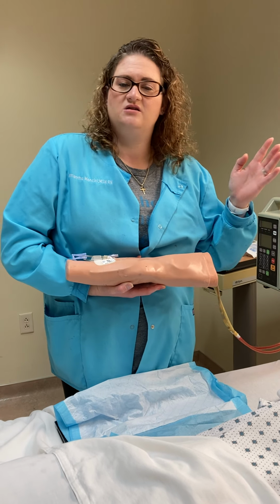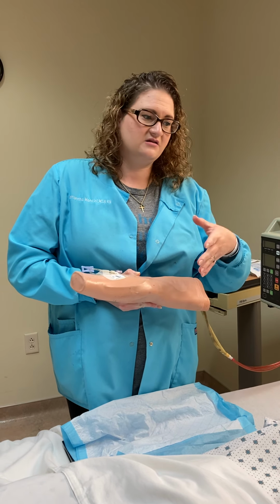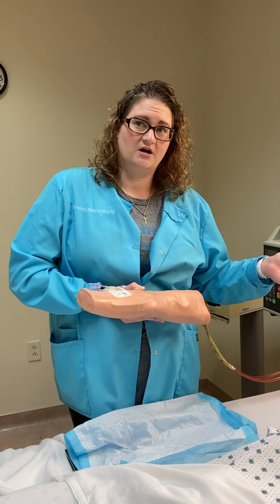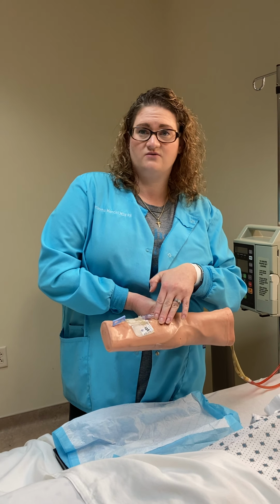There's all kinds of stories out there of, for whatever reason, usually it's due to severe exhaustion of a nurse, or maybe a patient accidentally switching their lines around, being connected to the wrong thing. They could be getting the wrong medication to the wrong area, so on and so forth. So we always want to trace from our line back to make sure it's going to the right spot.